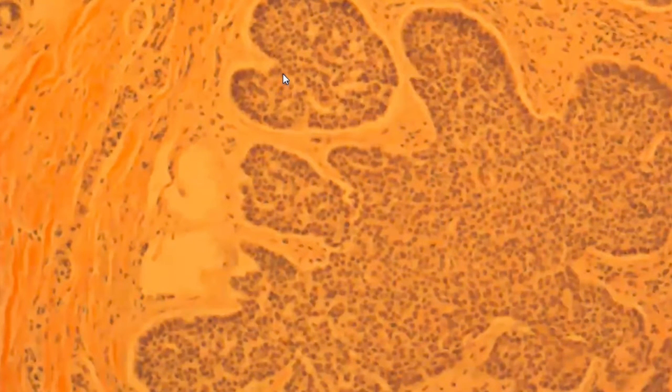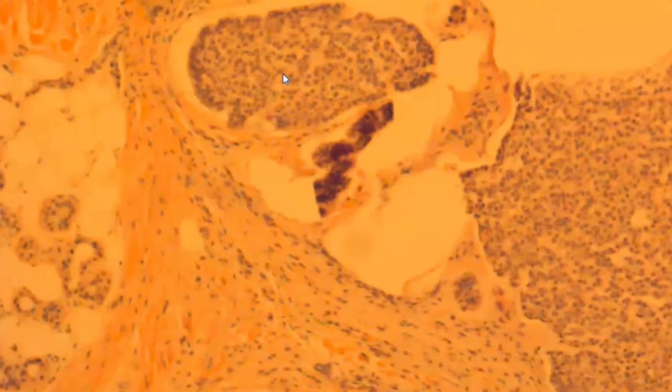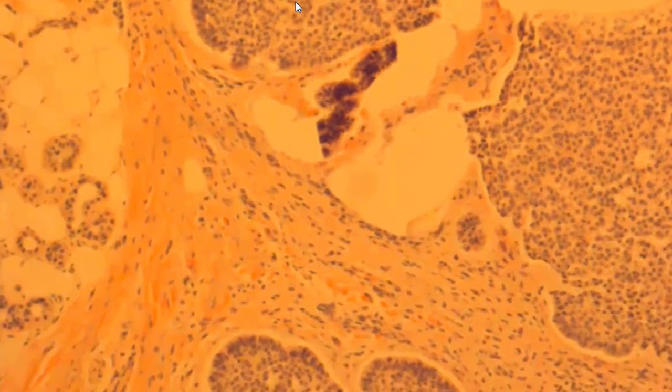This tumor is hyperchromatic with scant cytoplasm. See how it's coming into the dermis, and all the cells here are hyperchromatic. Again, here you can appreciate this palisading and the stromal retraction surrounding the lesion.